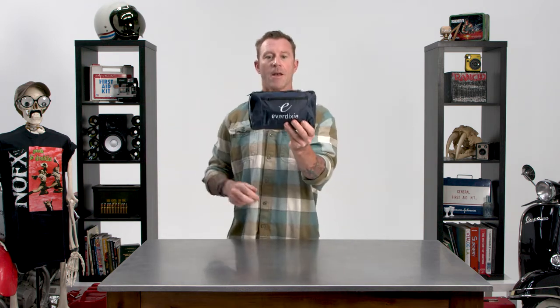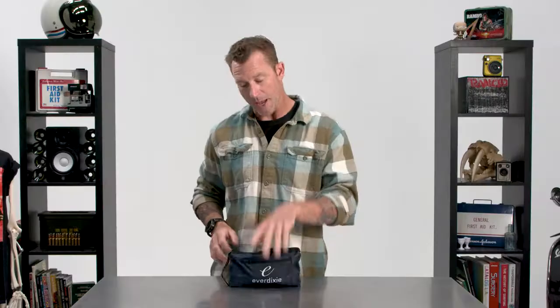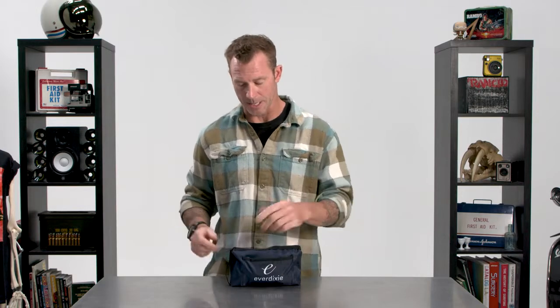Hey, what's up everybody? Today we're exploring the anatomy of the blood pressure kit. Blood pressure is a fantastic diagnostic tool and this kit has everything you need to make that happen. Let's go ahead and check out what you get in the kit.